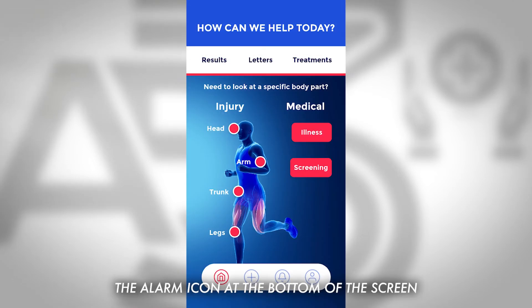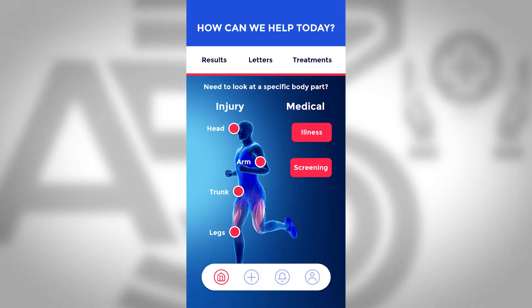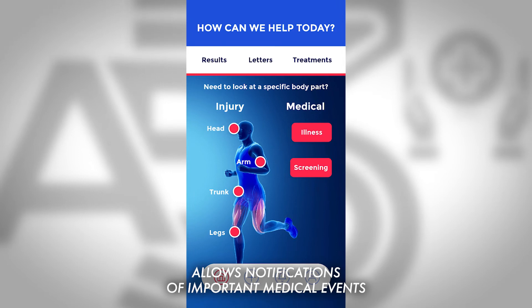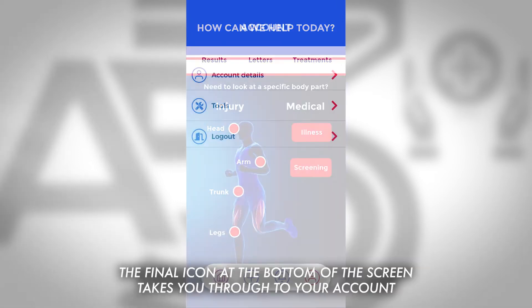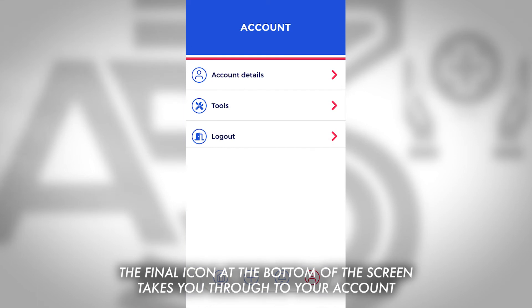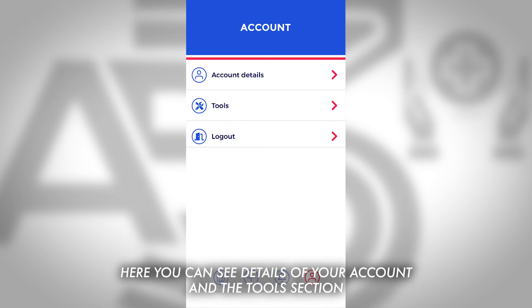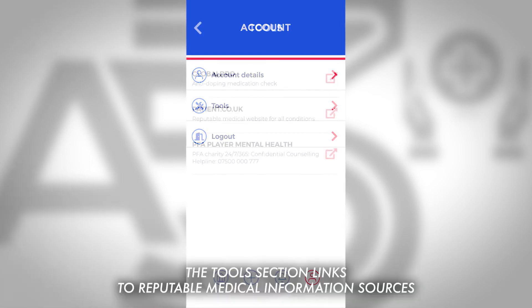The alarm icon at the bottom of the screen allows notifications of important medical events. The final icon at the bottom of the screen takes you through to your account, where you can see details of your account and the tools section.